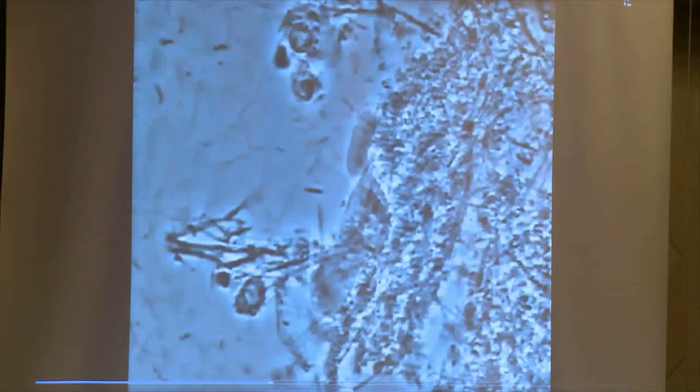Well, basically, you've seen all the bacteria. Unfortunately, I didn't have any trichomonads that I could show. But again, this is an amoeba here. This is what the plaque mass looks like. You look for red blood cells and white blood cells. There is a white blood cell there.